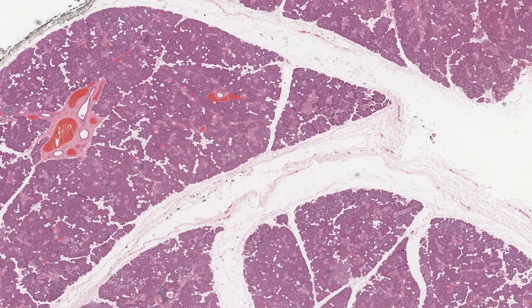Connective tissue divides the gland into lobules of various sizes, and you can clearly see profiles of sections through blood vessels containing stained red blood cells and excretory ducts. To show you more details, I'm going to zoom in to this region here.